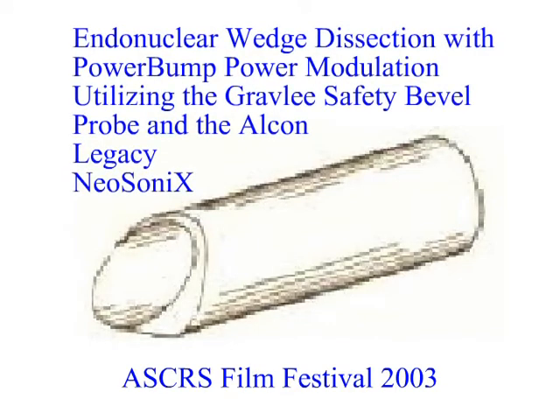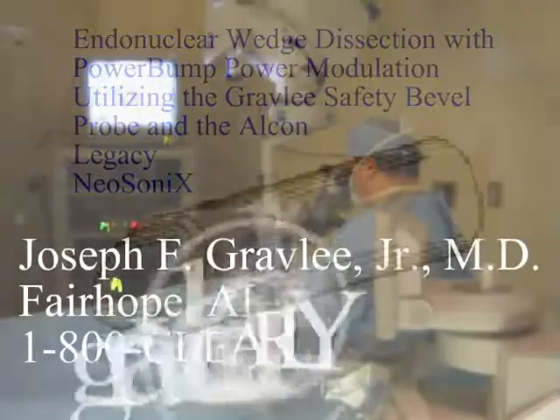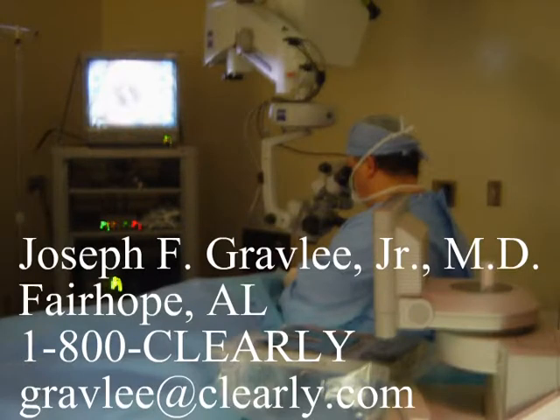Endonuclear wedge dissection with power bump is a new technique which showcases the Gravlee Safety Bevel Probe and the Alcon Legacy NeoSoniX with programmable Advantech software.